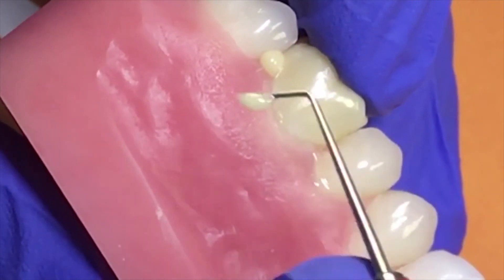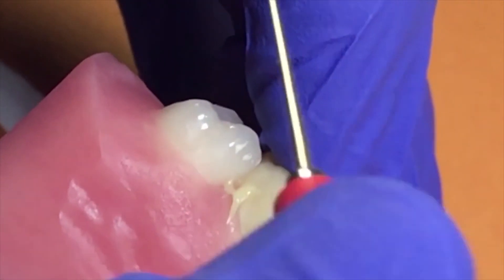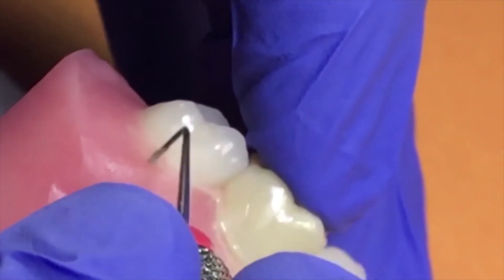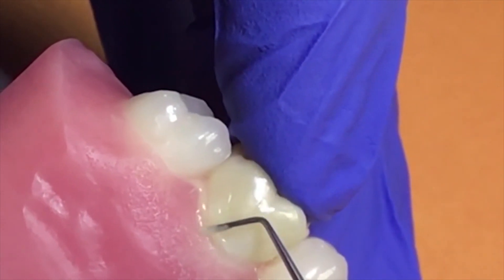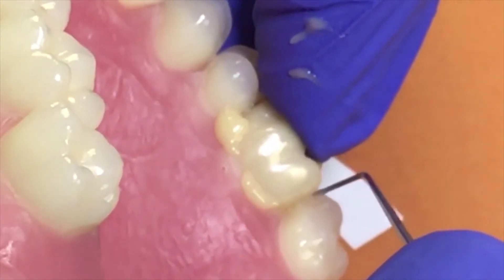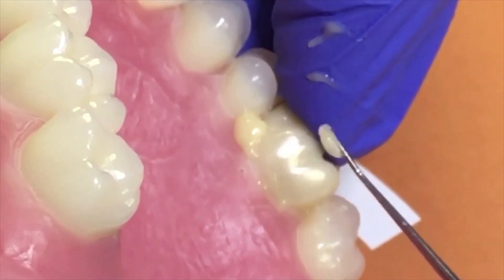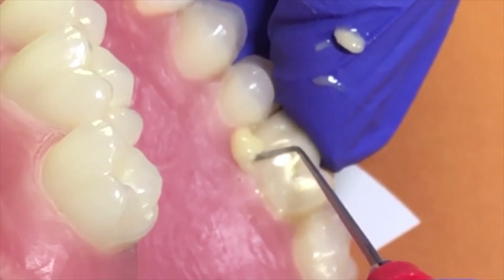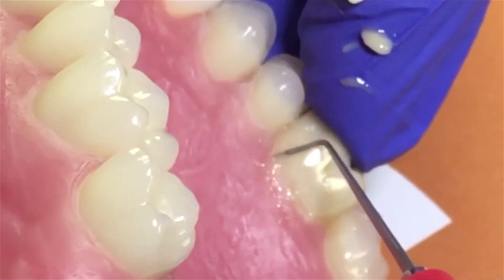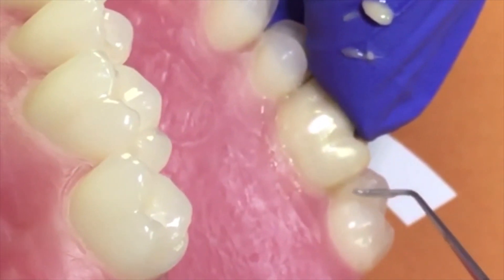Simply take your explorer, remove the excess, and floss the interproximal contacts. Because of the high bond strengths in the self-cure mode, as we discussed earlier, you can be assured that even though we're cementing a zirconia crown, which is extremely opaque, you will still get conversion of the resin cement into its final cured state. The gel state makes it even easier for the cement to clean up. With self-etching resin cements, it's important that you allow the cement to self-cure first prior to hitting it with the light. Not only will it make cleanup easier, but it will also allow the cement to reach its final cured state.